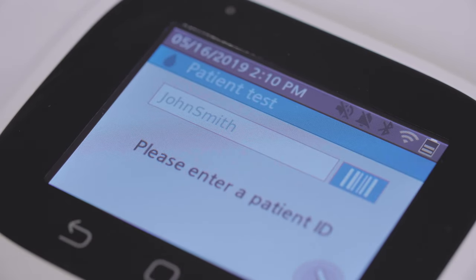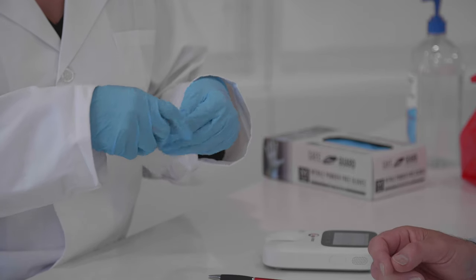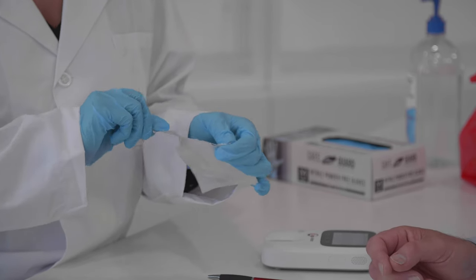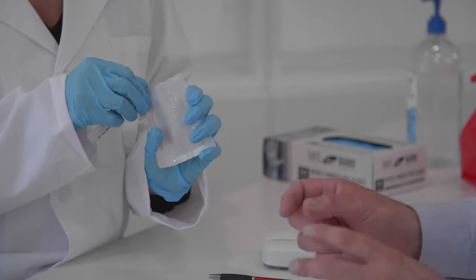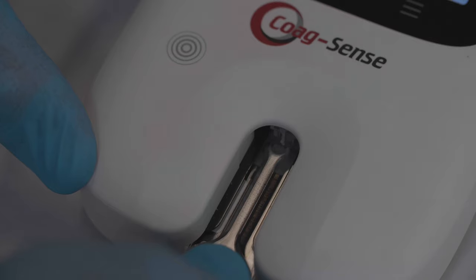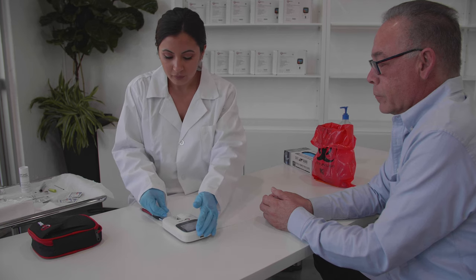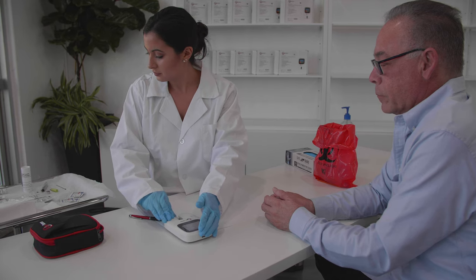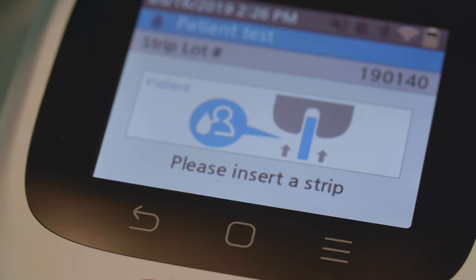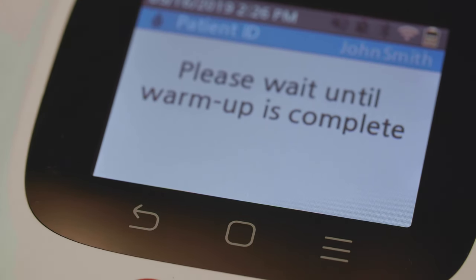Press the continue button. The display will now show the message to please insert a strip. Open a PT test strip package, tearing at the notched end, and remove the strip. With the wheel facing up, hold the round end of the test strip and gently push the strip completely into the meter. The strip fits snugly when pushed all the way toward the back wall of the strip holder. It is suggested that the back of the meter be held with one hand while using the other hand to insert the strip fully in a smooth motion. When the test strip is correctly inserted, the display will read please wait until warm-up is complete.